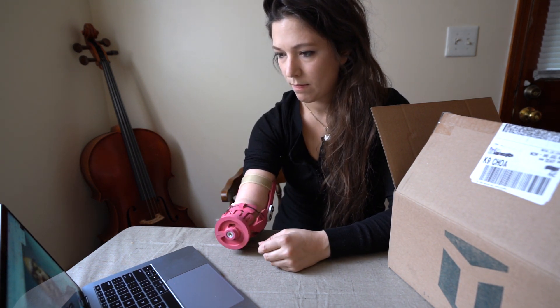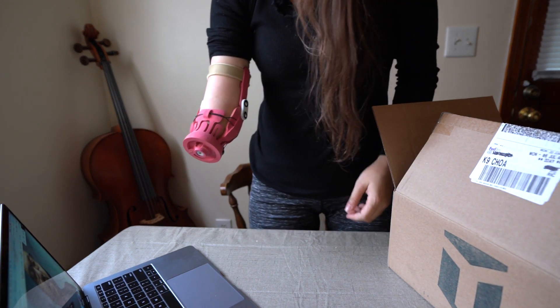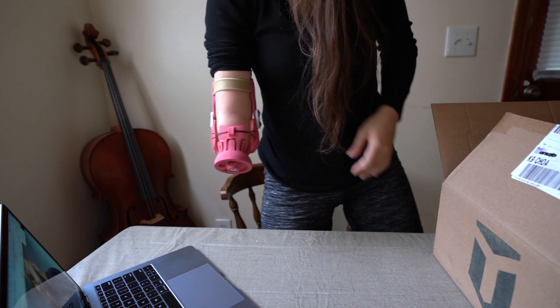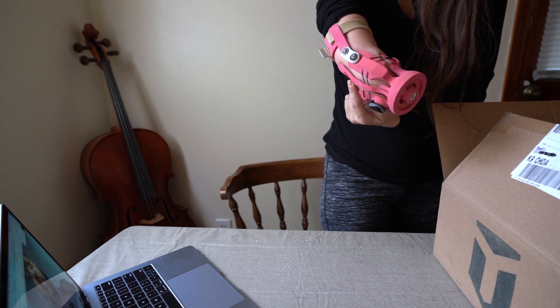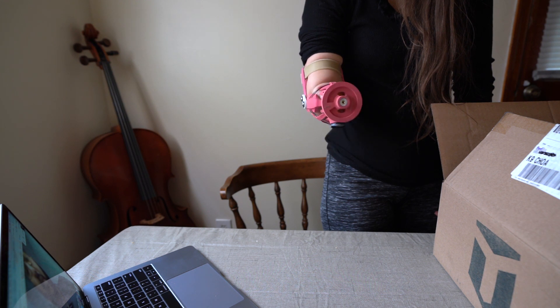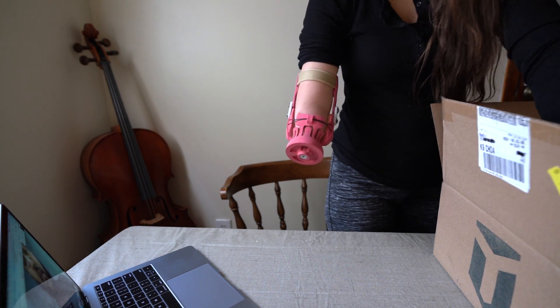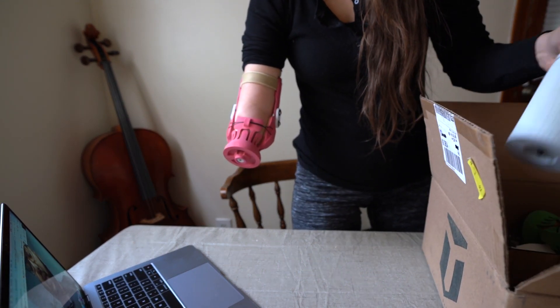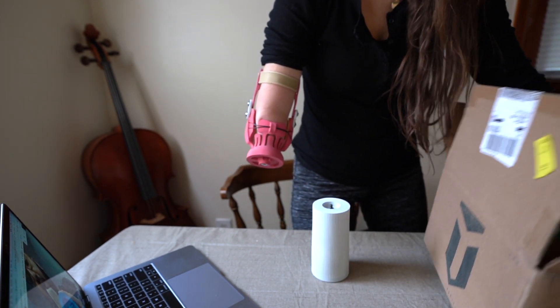The clinician asks Abby to stand up and show her arm in view of the camera — full body, side profile. He then asks her to have her arm by her side and bend at the elbow three or four times, then go ahead and attach the weight. There's a screw on top of the weight that screws right into the bottom of the socket where there's a little white insert.